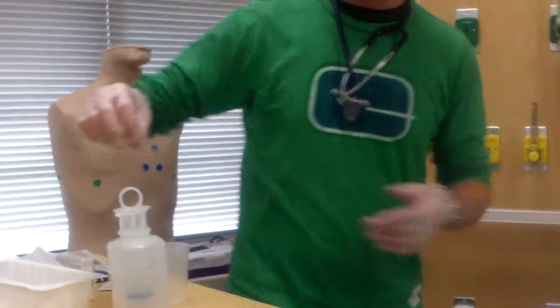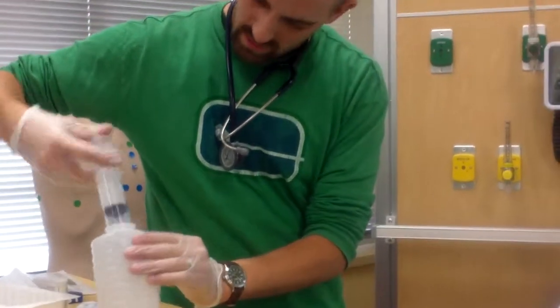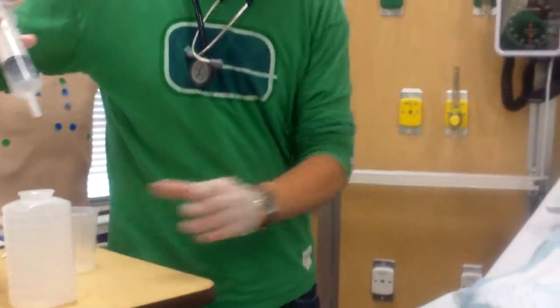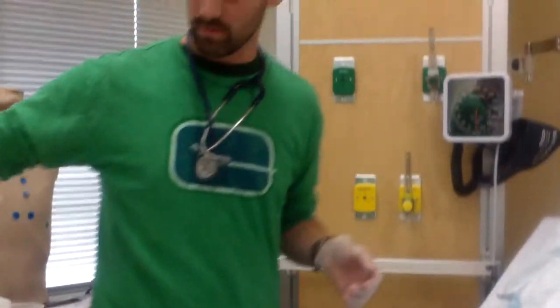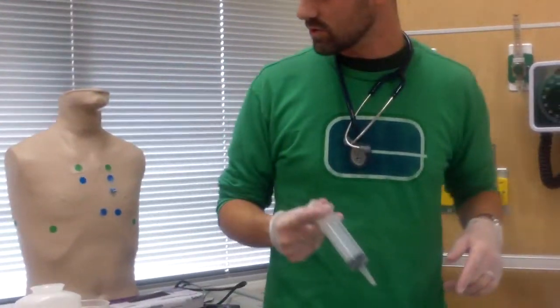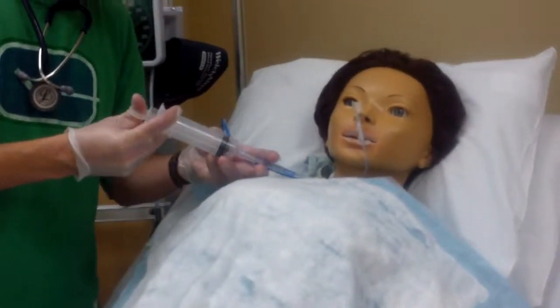So now I need to flush it. So I'm going to withdraw about 30 mLs. Where's that? There we go. A little bit more. Okay, 30 mLs. Hold on. We also have to check for the residual amount of the stomach contents, because we got to make sure that it's less than 400 milliliters before I do this. And I would also want to note how much I'm flushing with, so I can put that on my I's and O's chart as well. So I needed to check the residual after I did that. So then I'm going to do all of this.